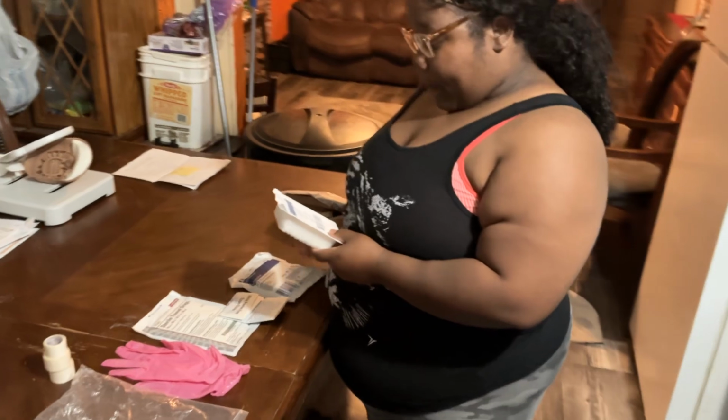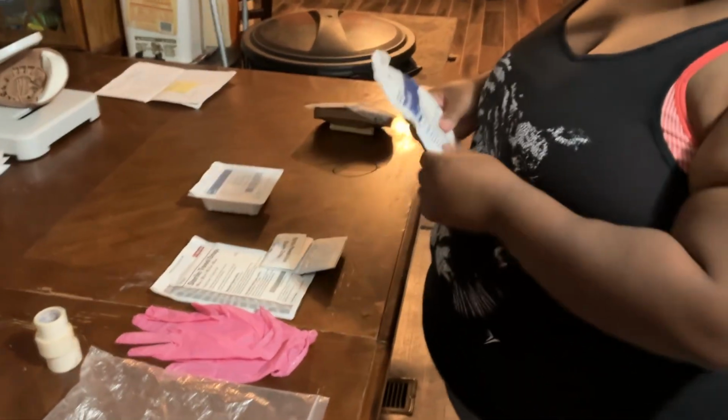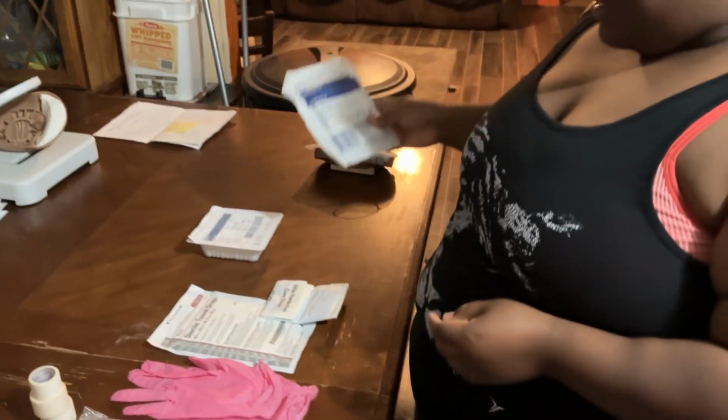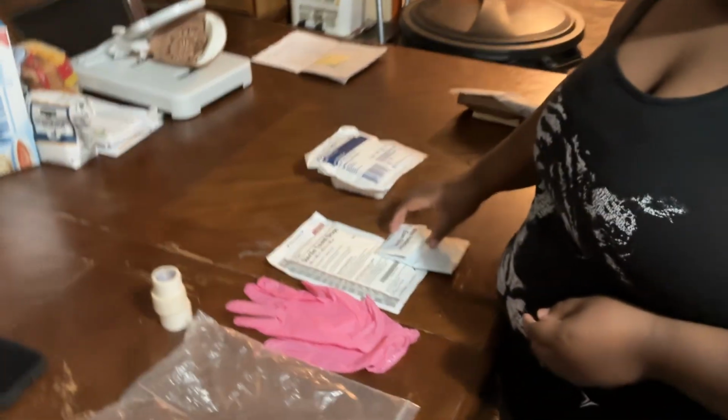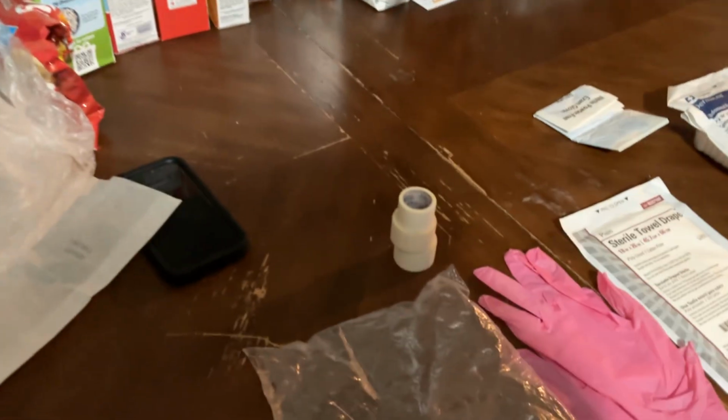Okay, I have my gauze sponges. I have my ABD pad. I have my sterile gloves. I have an extra pair of gloves that's going to be needed. And I have my drape, my tape, and I also have my trash bag.